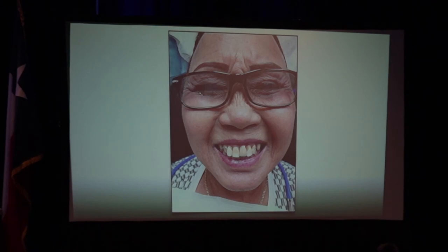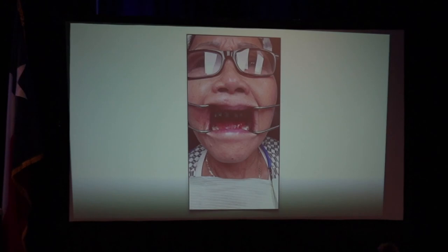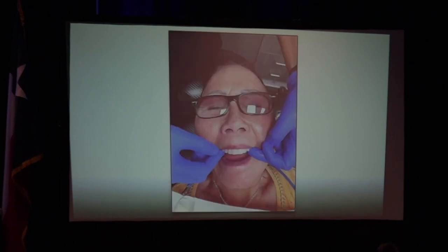I did this case. She came in on a Friday, and I did the surgery on a Saturday and got her teeth. I wouldn't recommend all those, but you've got to get your workflows down first. Place the implants, six implants, and this is her temporary I delivered. And she healed, and I didn't even see a post-op on her. I usually want to. She just couldn't make it back. She was older.